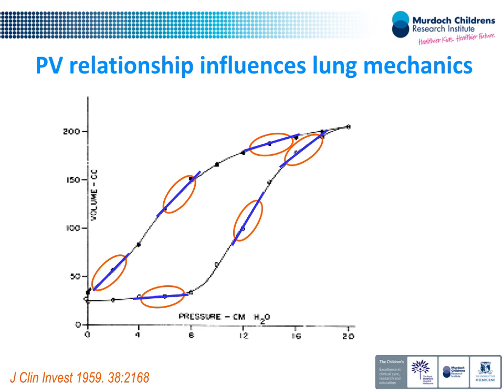So why would you change? Well, because 12 might be too high. You might have achieved the same with 8. 8 means extubation. So at least we said every 12 hours. You need to challenge this lung and go down with the pressure to make sure that the 12 is still necessary. In preterm.